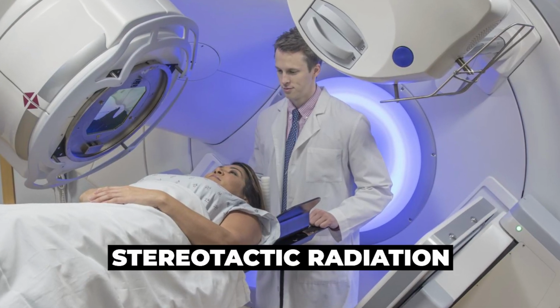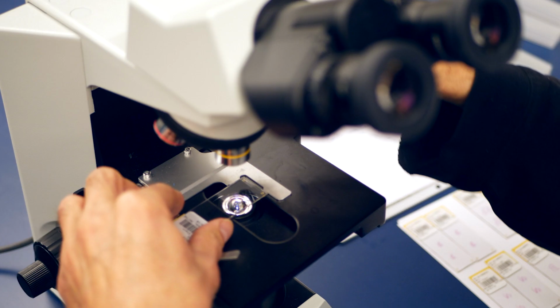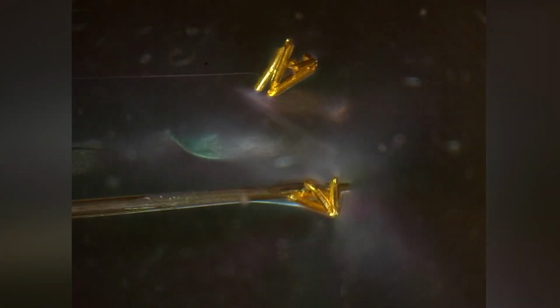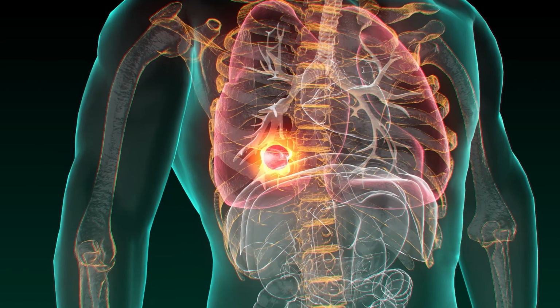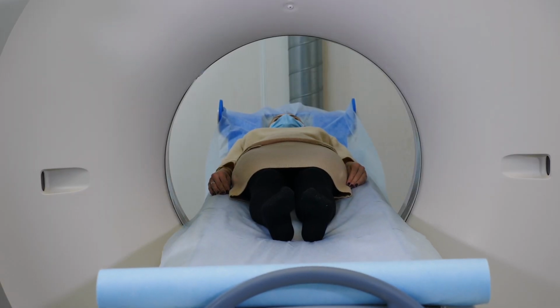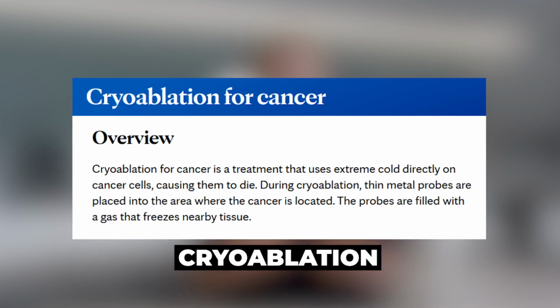Well, recently there is good data that other alternative treatments like stereotactic radiation can be as good as surgery for very small tumors. More often than not, they require a biopsy and also placement of a fiducial marker, which is a little gold seed that we implant in this tumor so the radiation machine can focus on that. They also don't always work, and there are recurrences associated with that. And if you have a recurrence, usually you cannot have radiation again, or there's a limit to it. So that's why some patients may need something else, and that something else can be a cryoablation.